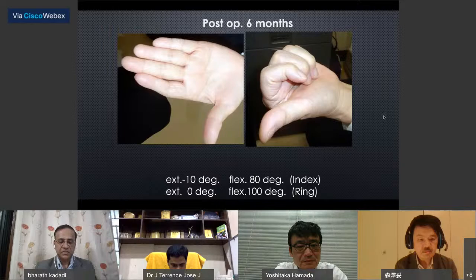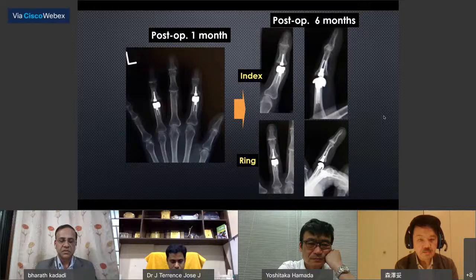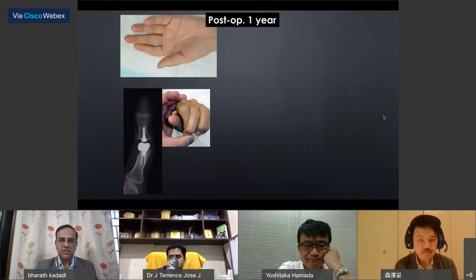X-ray on the left. Post 1 month after operation, there was no problem, but X-ray on the right. Post 6 months after operation, there was slight displacement of the index proximal phalanx implant. Then observation was adopted. But 1 year after operation, more displacement. Ulnar deviation, instability, and cross finger appeared.